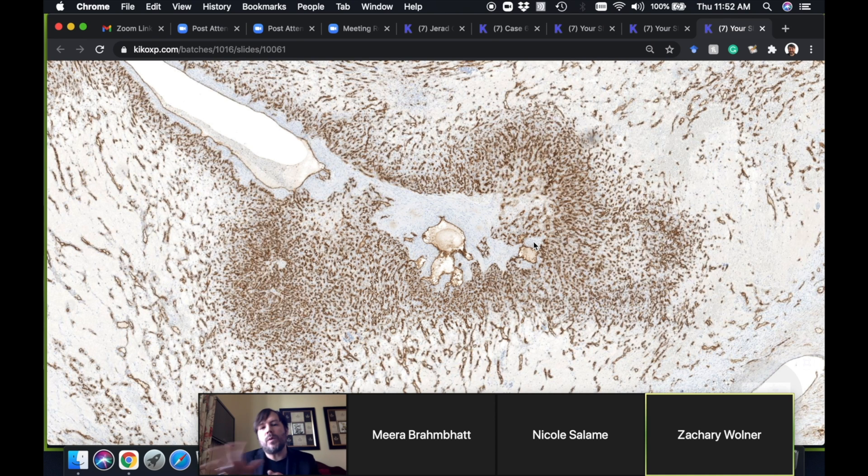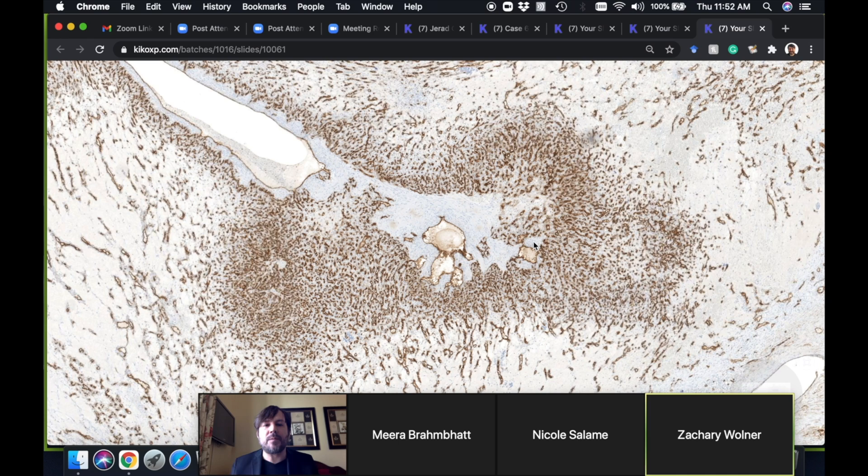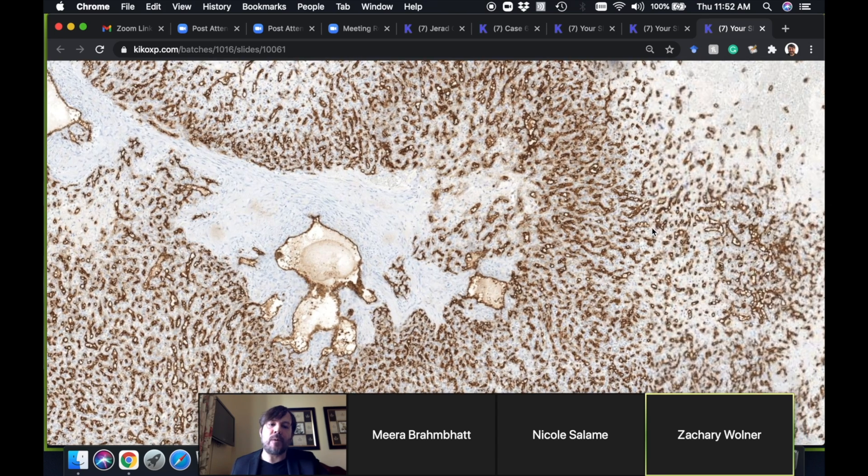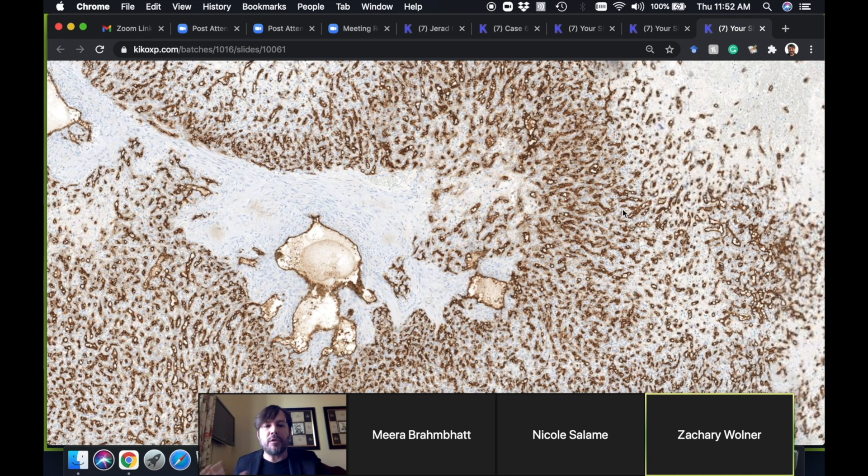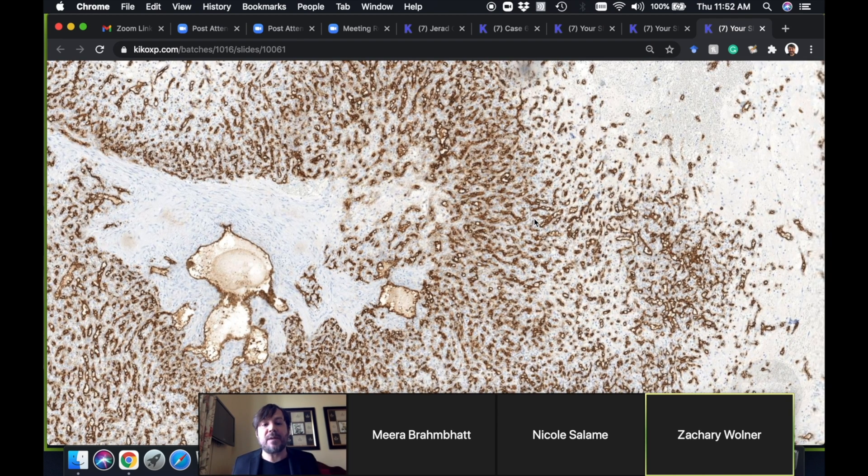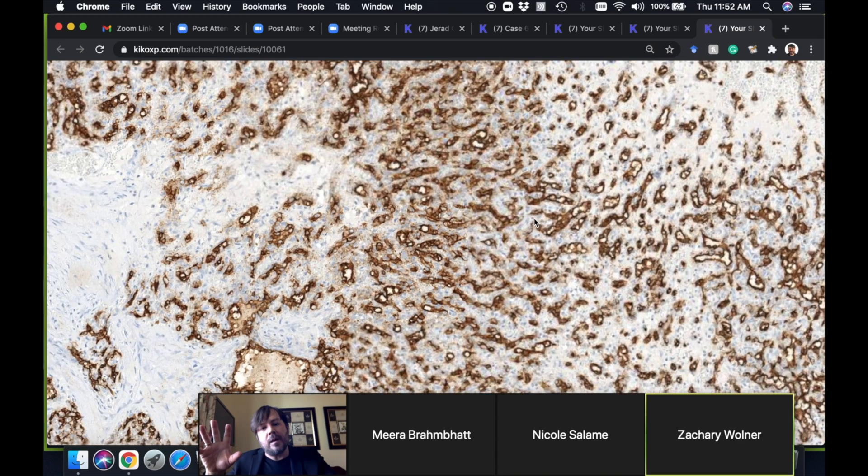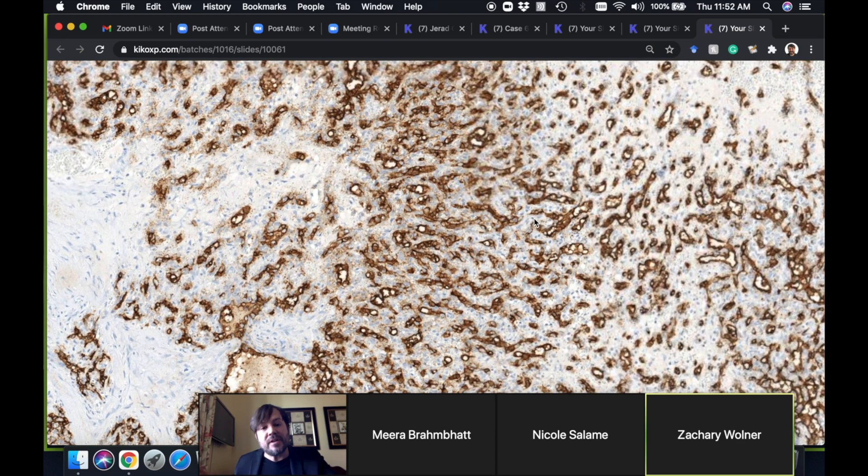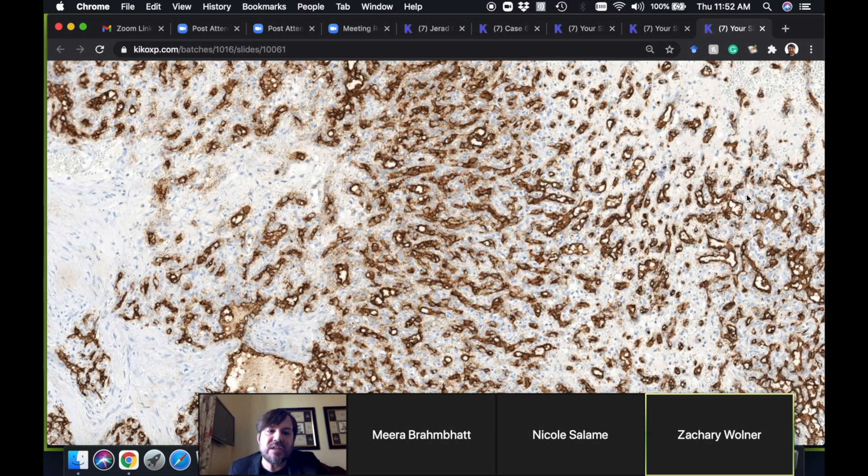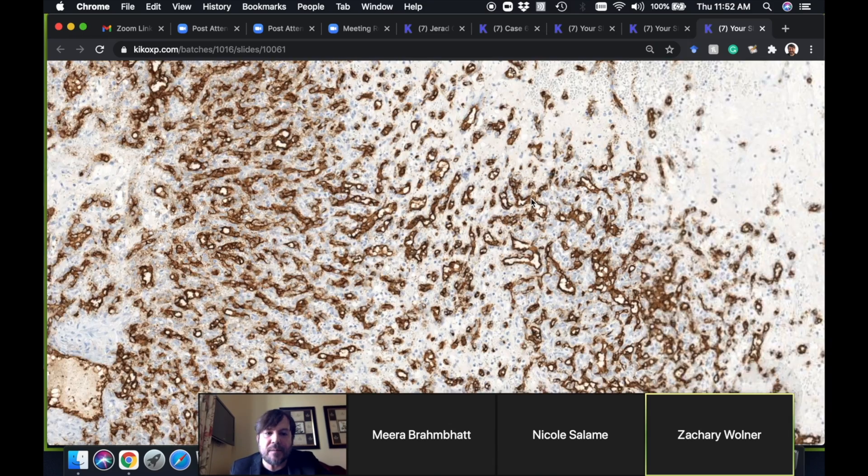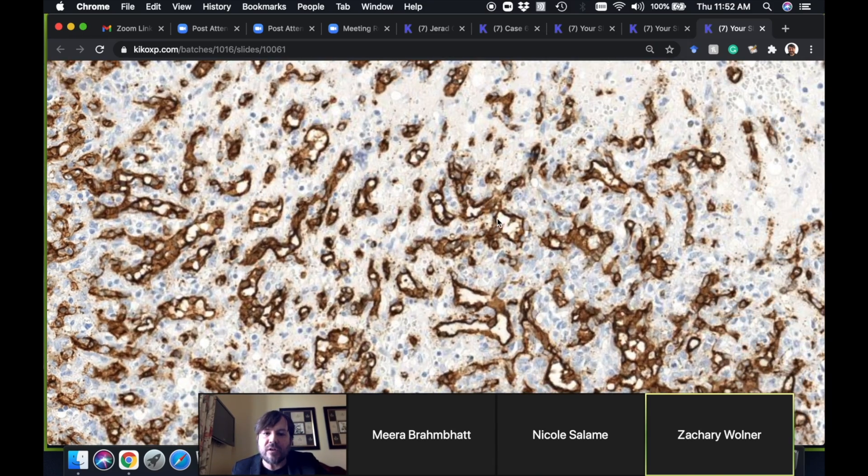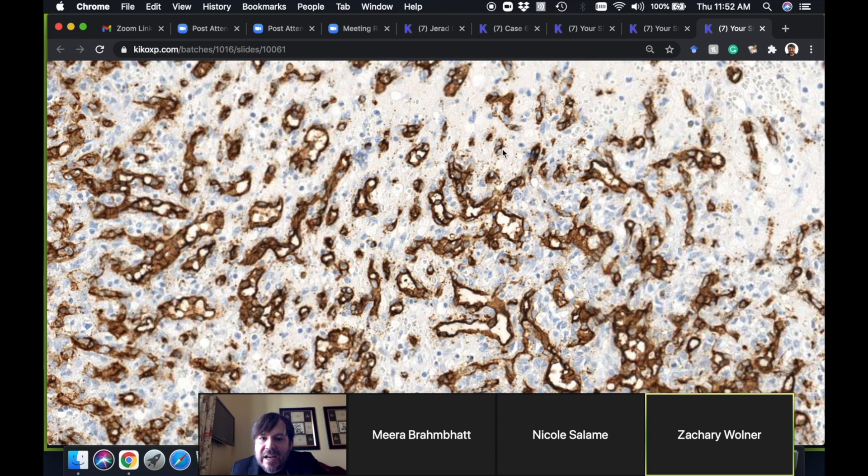This one was not so much that way, but sometimes that can happen and it can be very hard to tell what the actual pattern of the vessels is. I find that doing CD31—you can do ERG, although this is a time that I like CD31 better because it's a cytoplasmic and membranous stain rather than nuclear—it tends to give you these nice sharp lines around each vessel. Look at that, beautiful! You can see every single vessel space, even these small ones—tiny vessel, tiny vessel, tiny vessel.